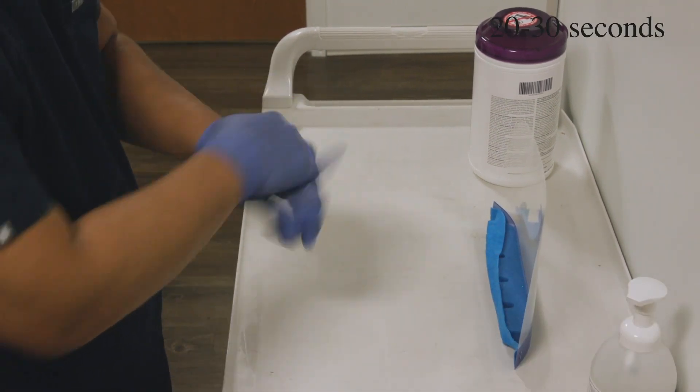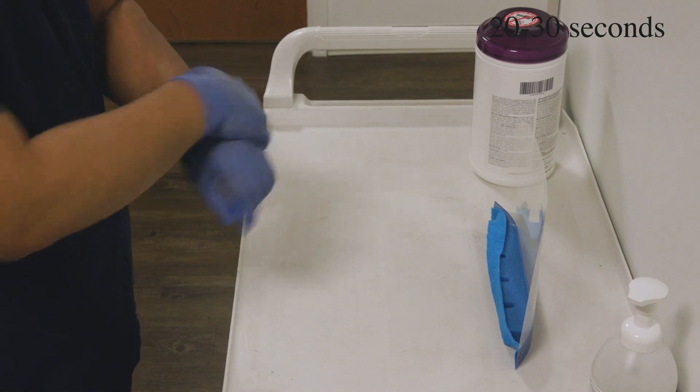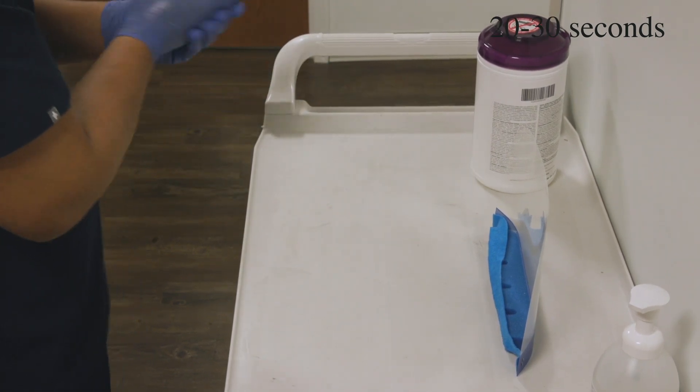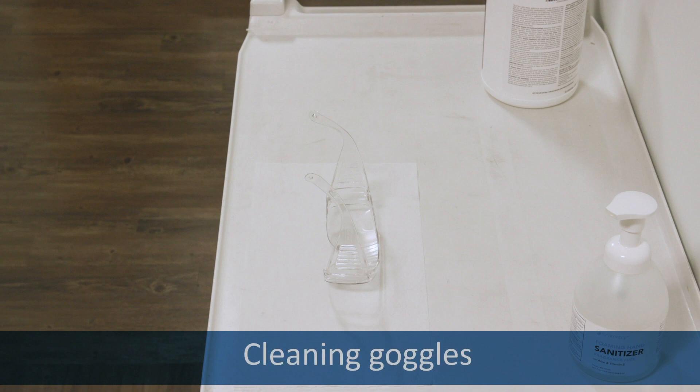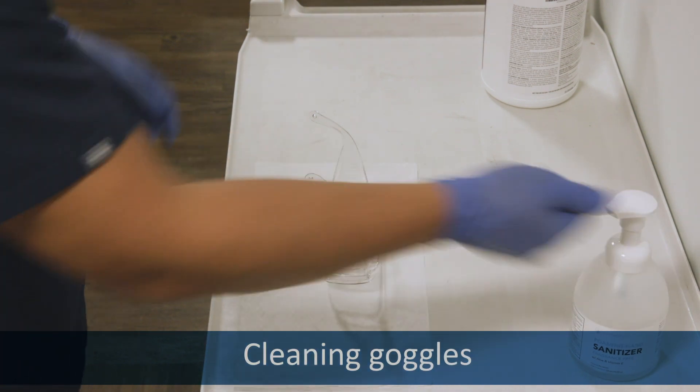Sanitize your gloves. Or, if you're using goggles, lay them down on the clean area. Sanitize your gloves.